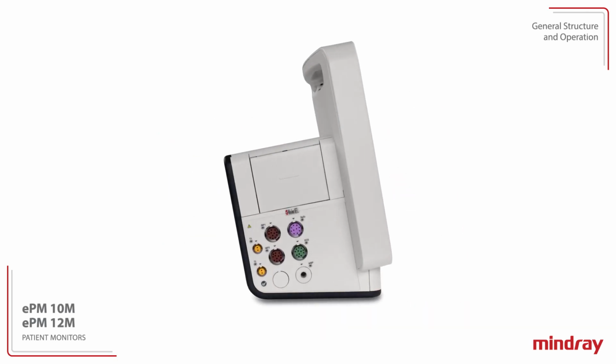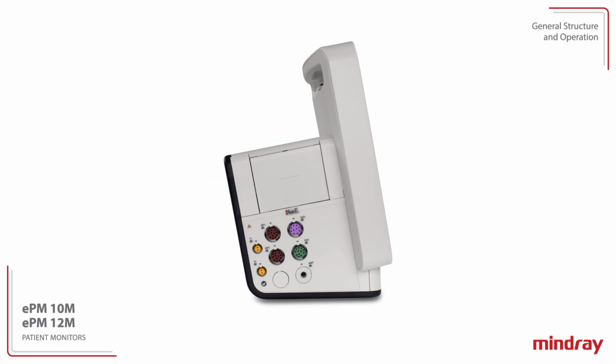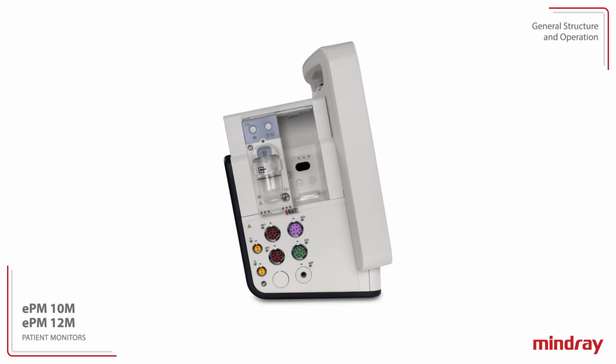The ePM 10M and 12M patient monitors have an integrated module rack for optional external parameter modules, such as CO2 or invasive blood pressure. To connect a parameter module, push the module rack door in while lifting. Slide the module into the slot until it clicks into place. To remove, lift the latches at the bottom of the module to release and slide the module out.